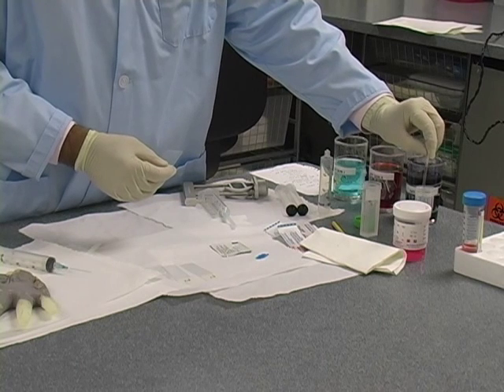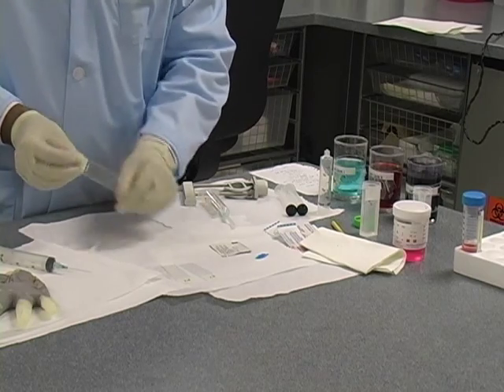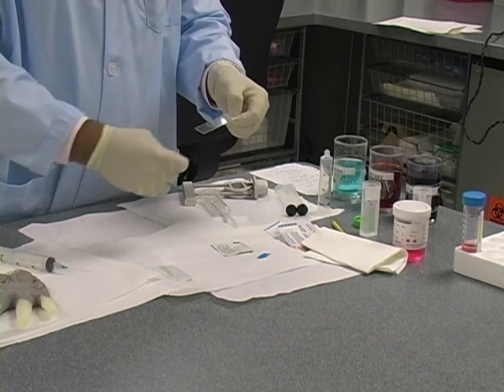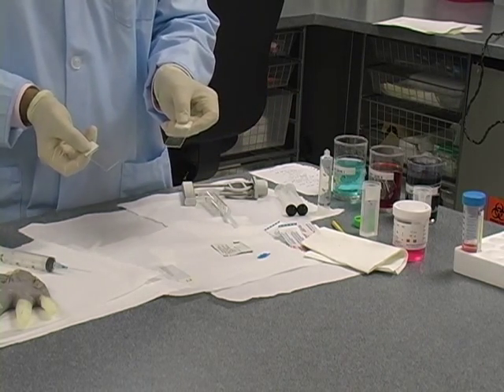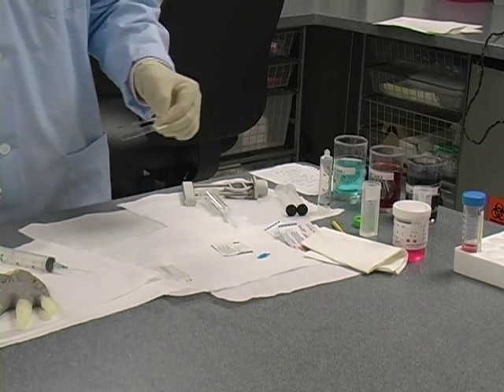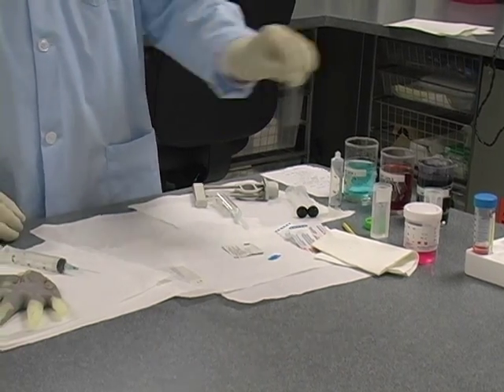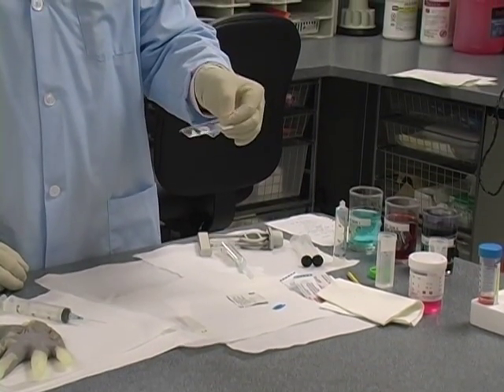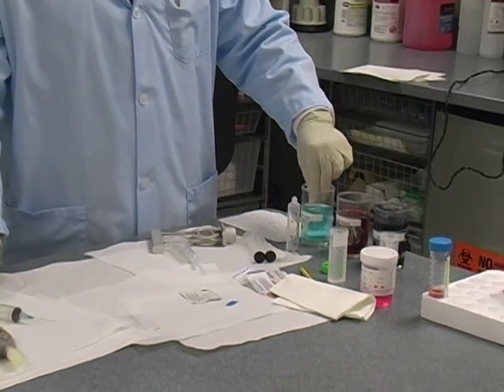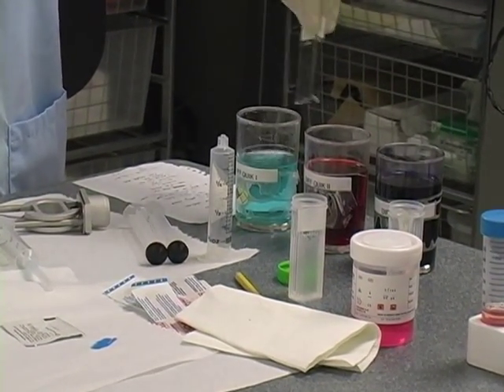The alcohol-fixed slide goes directly into alcohol. The one for Diff-Quik I smear with a spreader. Now I have two Diff-Quik air-dried slides. I can use the hair dryer to air-dry these quicker, or just wave the slides back and forth. This material is not very bloody, so you can see it's quite dry. Then the same technique — dipping it in the first solution, second solution.